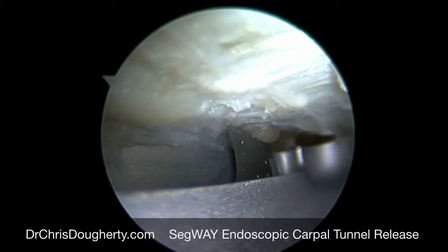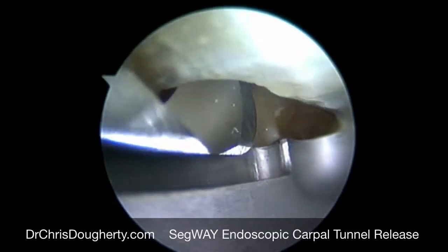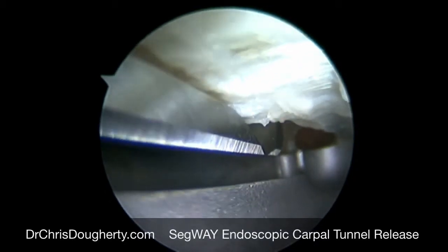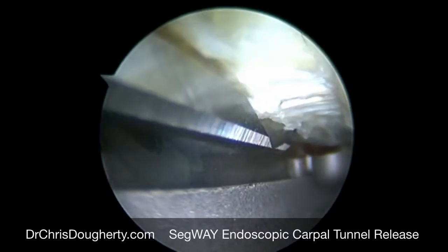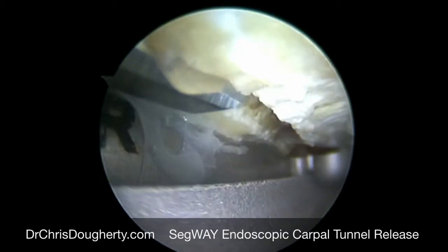The guide is protecting the nerve beneath us, and we bring the knife in. Very gently, we start pulling back on the knife itself to cut through the ligament, and we go very slowly so as to cut only the ligament itself and not cut too deep at one time.